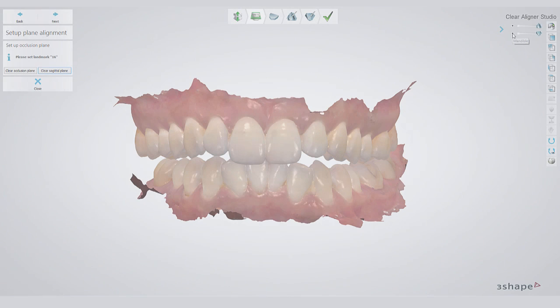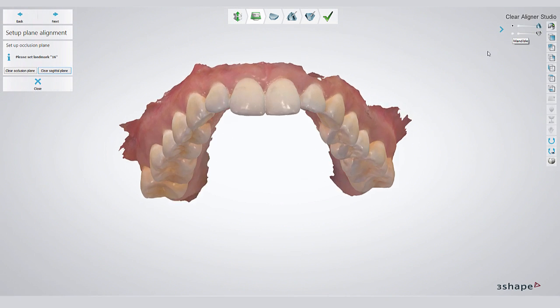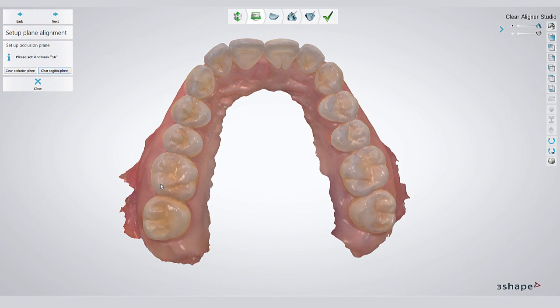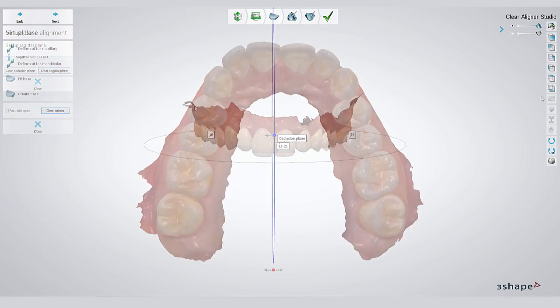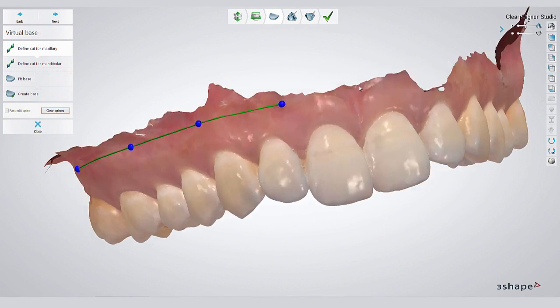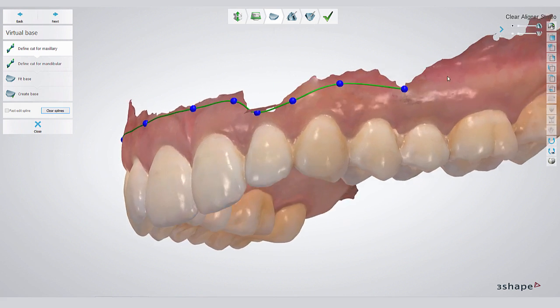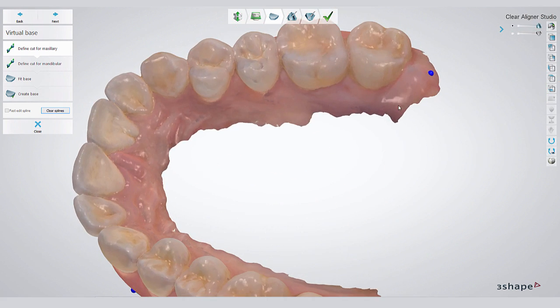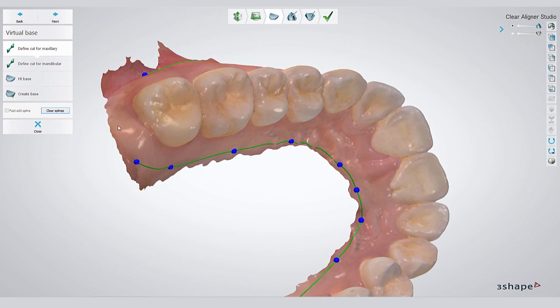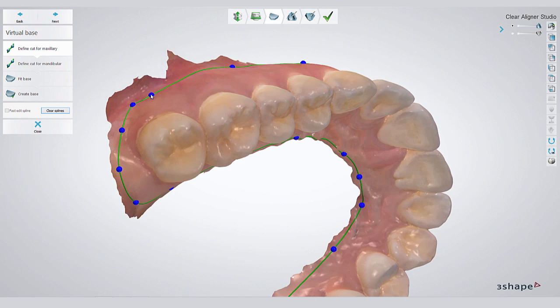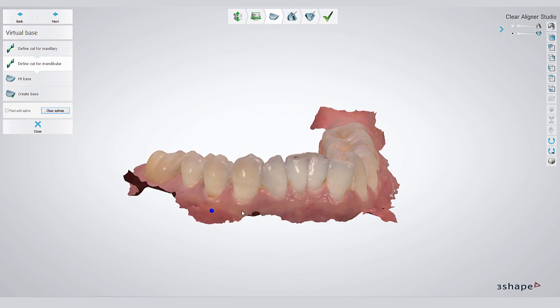Let's start the workflow with the first step of creating a model base. Three points will determine the occlusal plane, and a line drawn from the interproximal of the maxillary central towards the mid suture will then create the sagittal plane. Then you define the extension of the maxillary and the mandibular scan, and the software will add a virtual base.